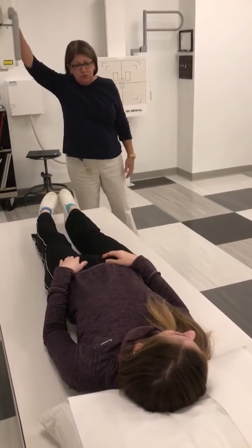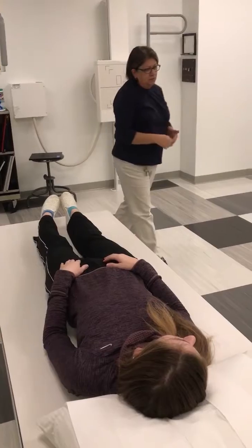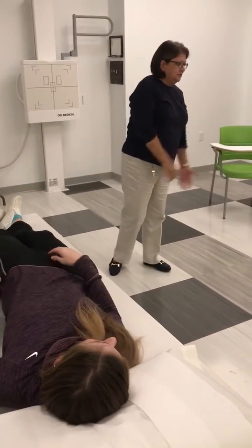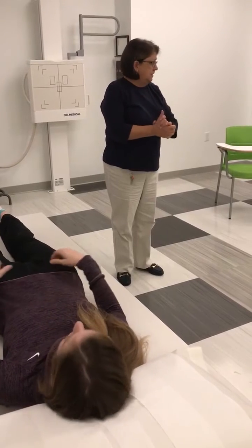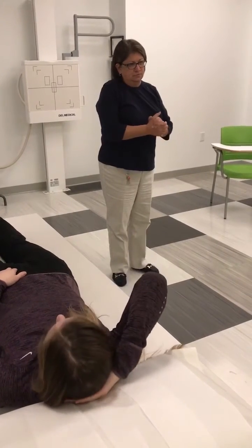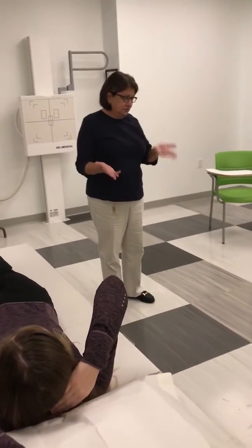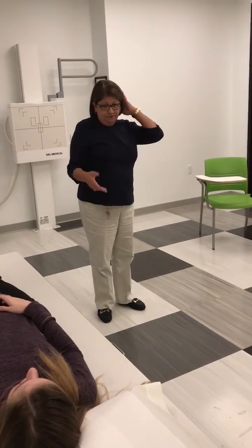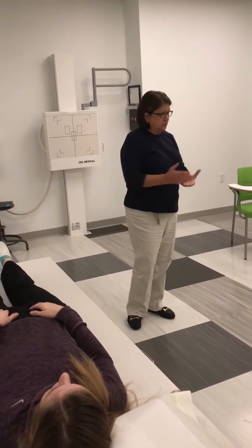So this is the IVU. As opposed to the lower GI, upper GI, and esophagram, these are not post-fluoroscopy images. They're images taken during the course of the exam, timed images. There is no fluoroscopy involved in the IVU. It's just injection and a series of timed images.